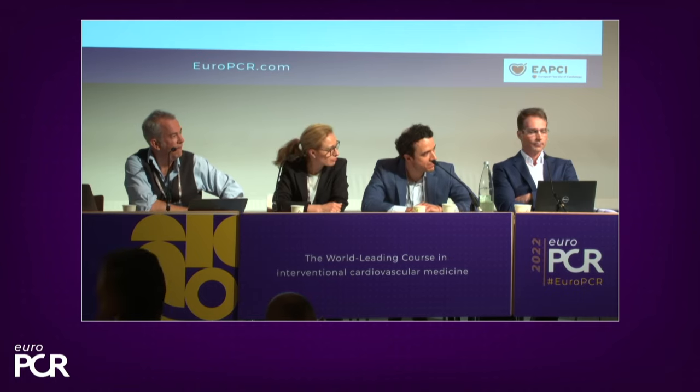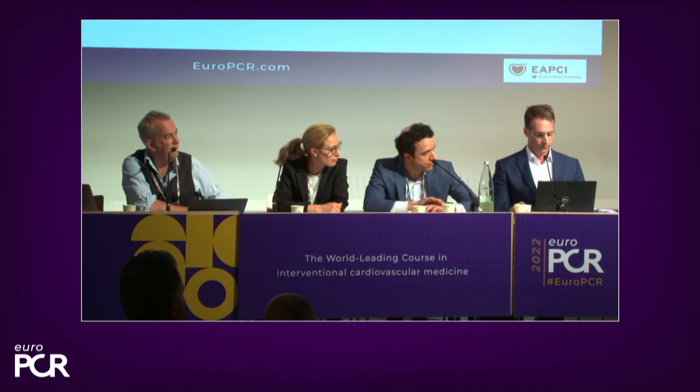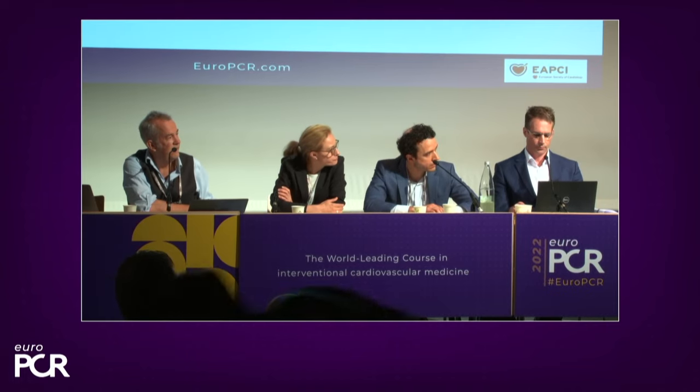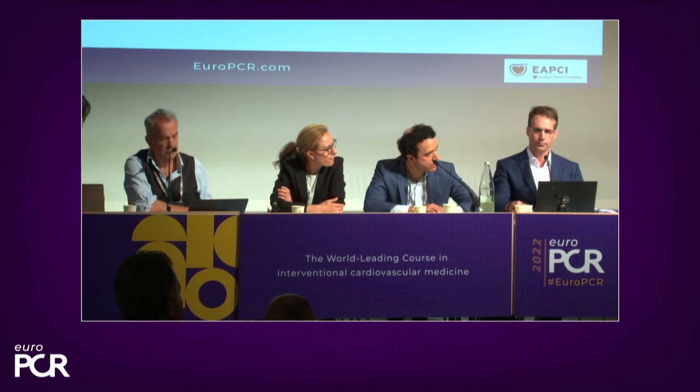Well, I think you raise a very important comment here, because there is a lot of controversy whether the need for a pacemaker is so important in terms of long-term clinical outcome. If you look at the five-year SIR-TAVI data, comparing patients who required a new pacemaker after the intervention, patients who did not have a pacemaker, and patients who had a pacemaker at baseline prior to the intervention, it turns out there was no difference in survival at 5 years between the patients with no pacemaker and those who required a new pacemaker. It was the patients who already had a pacemaker at baseline who had the worst outcome. So I do agree with what you're saying.